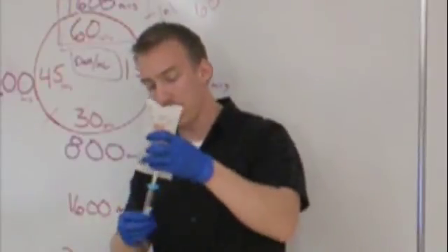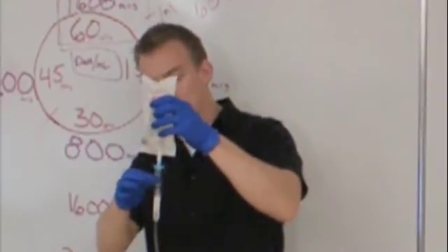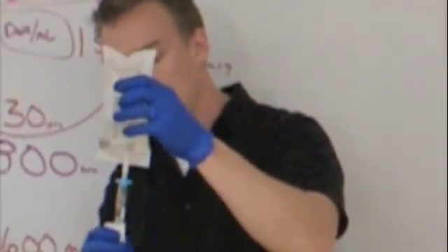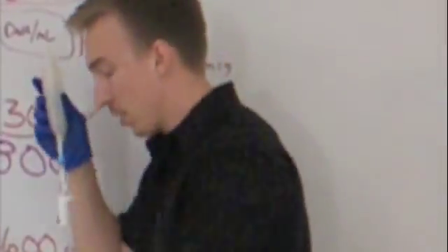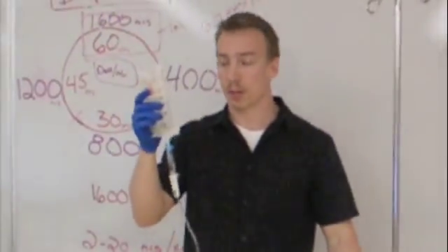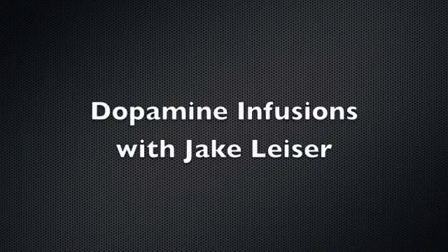So, just like an IV bag, there we go. Let me just give a few squeezes to purge any air out of the drip chamber, and then we're going to bleed our tubing off, hook this up to our administration site, and then we're good to go.